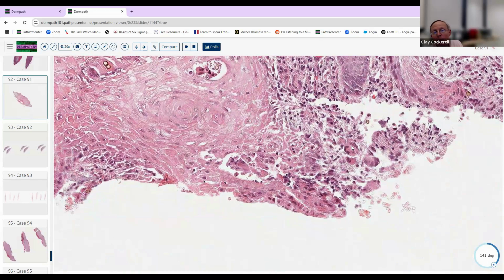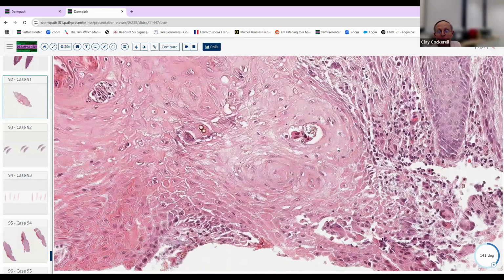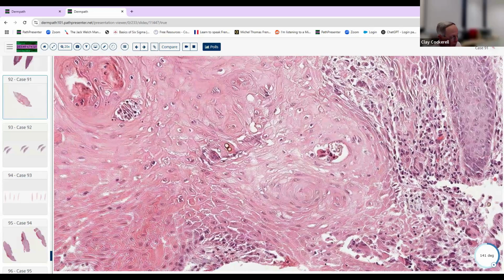They're going to show you enough that you're going to be able to find it. They're not going to make you spend an hour looking. You have 2 minutes a slide, so they're going to give you some time to find. Chromoblasto. Make sure you know a few of the organisms that cause it. They might ask a couple of organisms to see what caused it there.